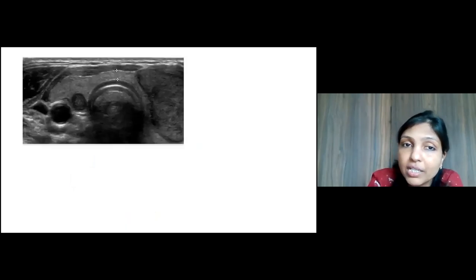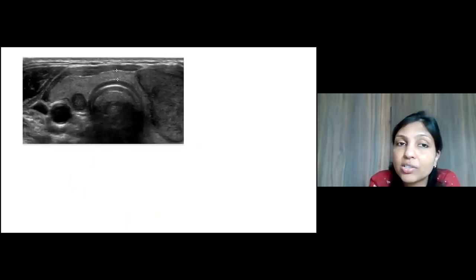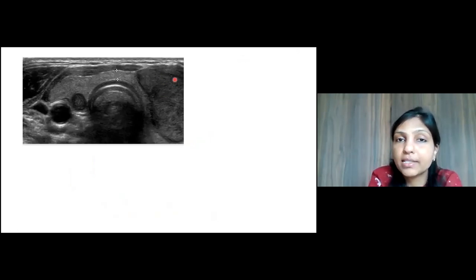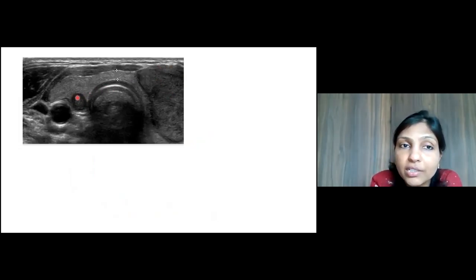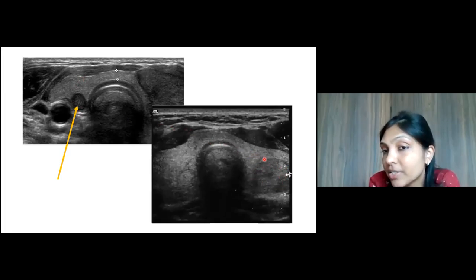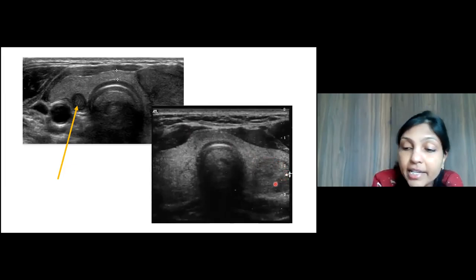In fact, just to show you a couple of pictures here, this is the transverse section of the thyroid as seen on the ultrasound imaging. And what we see here is a fairly large palpable nodule, but look at the little nodule here, which is deep in the parenchyma and often will escape palpation. Look at the other nodule in this picture. Again, a significantly larger nodule, but because of its deep location in the thyroid parenchyma, it may be missed.